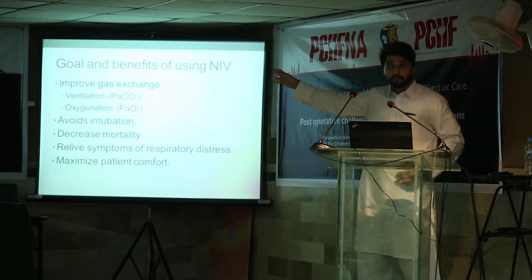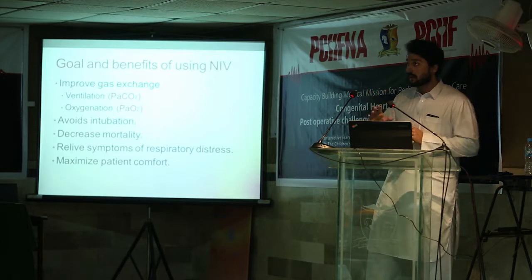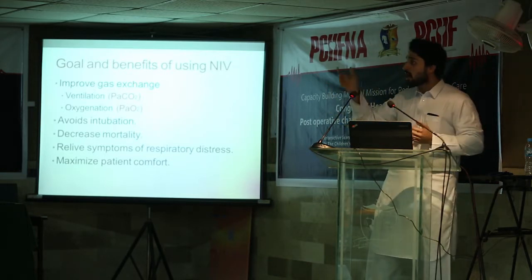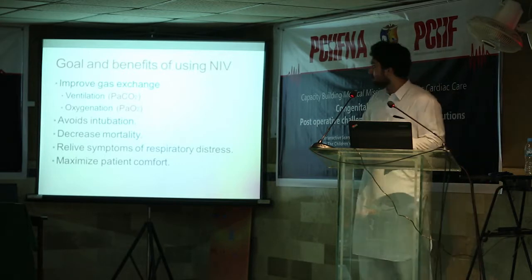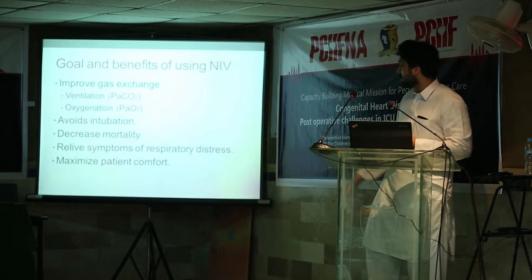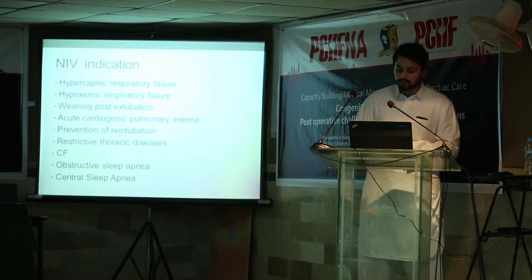What are the goals or benefits of using NIV? The most important one is to improve gas exchange. If the patient has a problem with gas exchange, like high CO2 or low PaO2, we can improve that non-invasively without directly going to an invasive ET tube. Avoid intubation, that's the main thing. Other benefits: decrease mortality and maximize patient comfort. We can make the patient more comfortable.